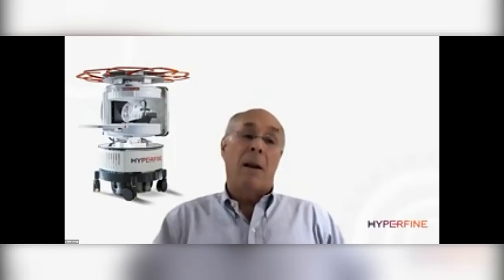I have no comment on that. Eddie, do you have any thoughts about that? Again, officially, you have to follow the manufacturer's guidelines. Anecdotally, from a variety of things, there haven't been any changes. For instance, programmable shunts in our pediatric hydrocephalus study and the like. But officially, party line, you have to follow the guidelines.